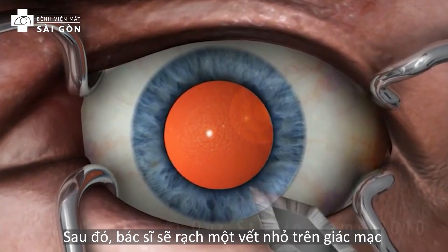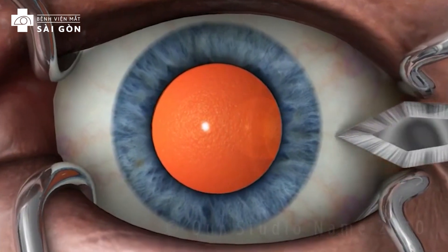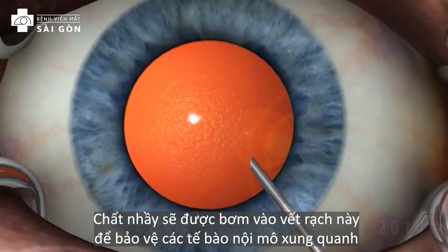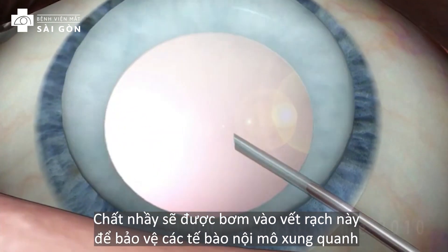Then a small incision is made in the cornea of the eye. Fluids are injected into this incision to support the surrounding structures.